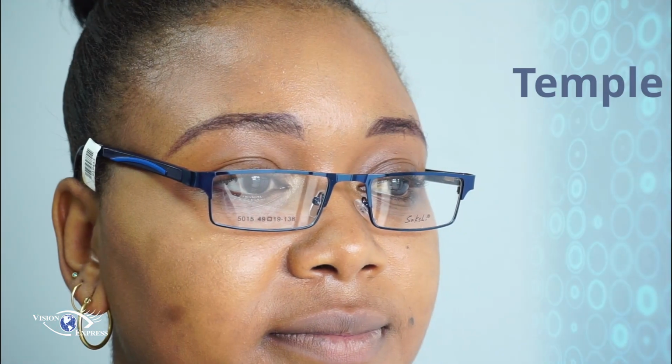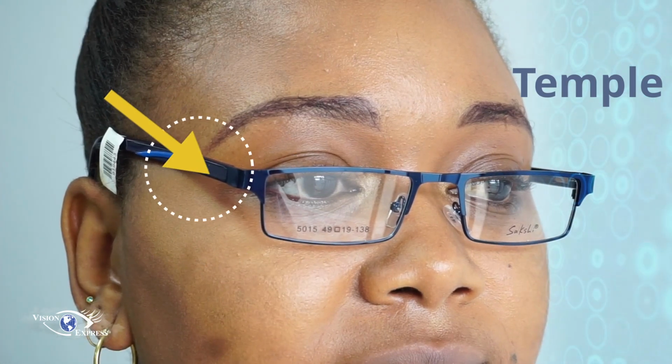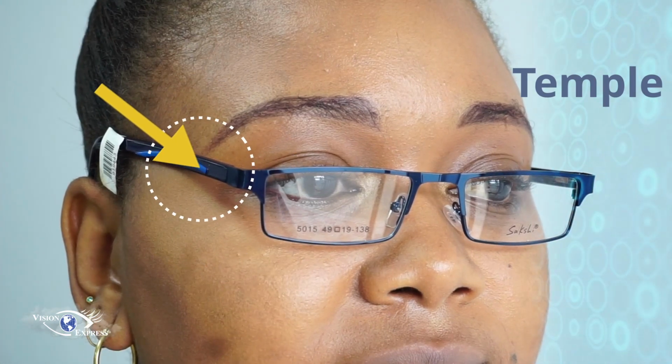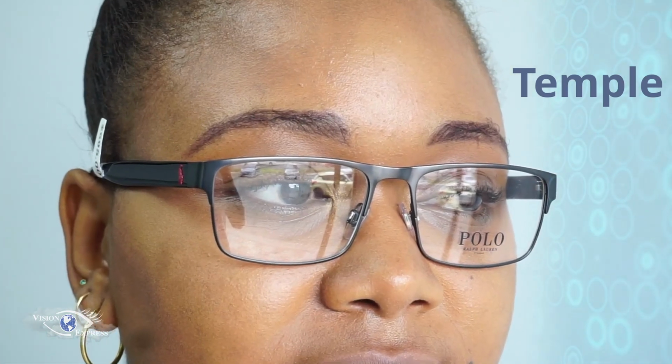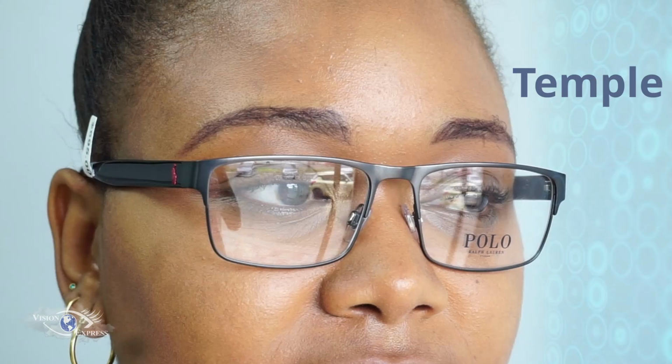The ideal fit is that the frame should rest comfortably on the patient's nose without leaving a gap. The temple. The handle of the frame should not press on the patient's temples. This can cause tension and even headaches. The ideal fit is that the handles rest lightly on the patient's temples.